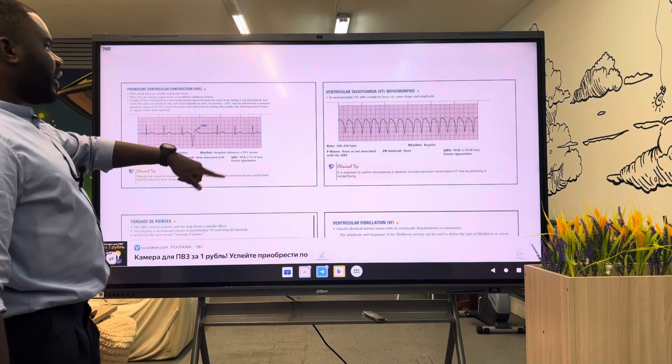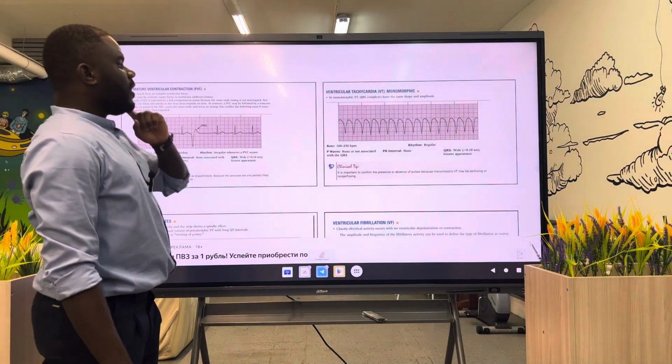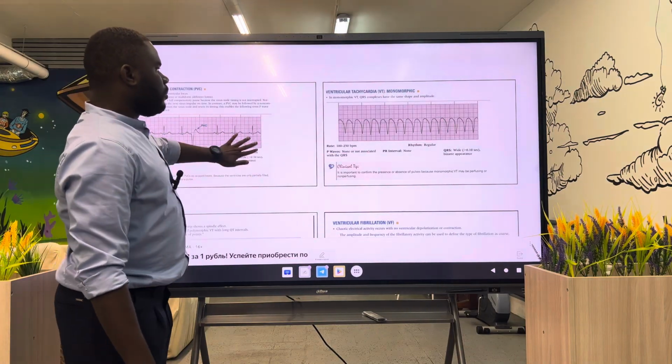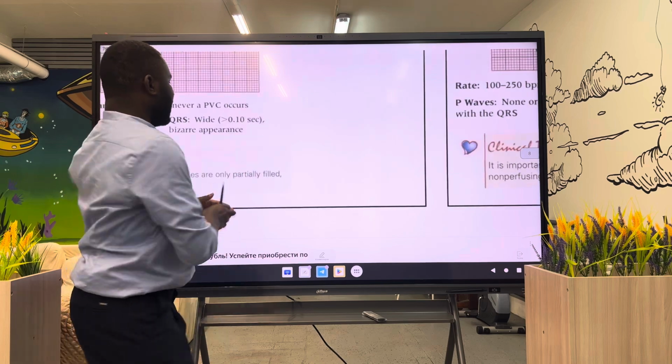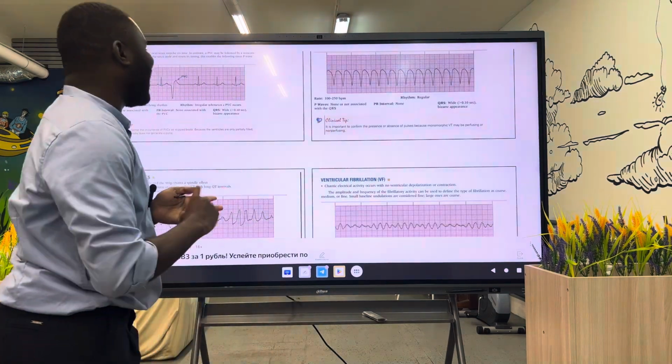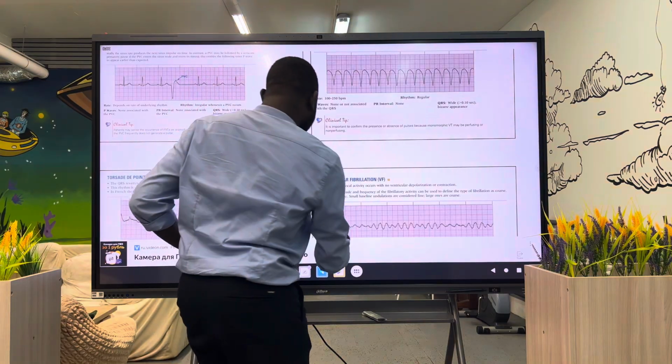Premature ventricular contraction we are going to do in our next class, before we do AV blocks. But today we want to clearly explain. Come here, come to me. So today we spoke about this.